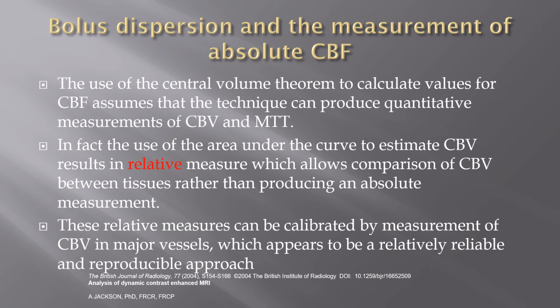So with bolus dispersion, using the central volume theory to calculate these values, if you get one of them, two of them, you can calculate the next one. You can get the CBV, MTT, and then use that to calculate your CBF. So CBV equals CBF times your MTT.